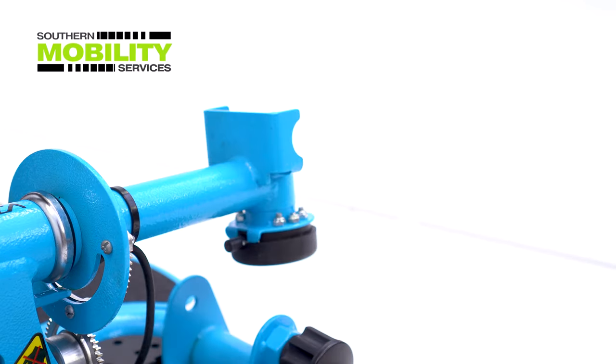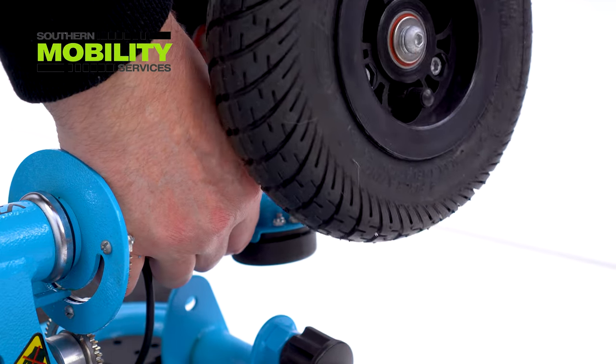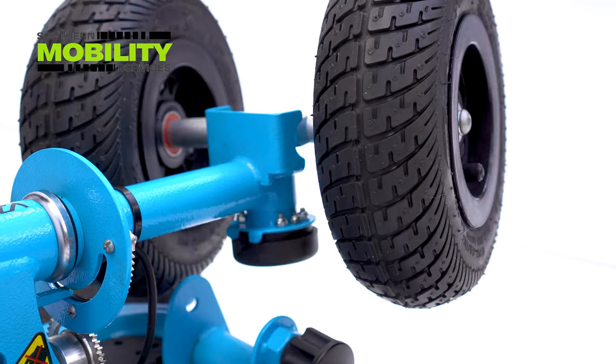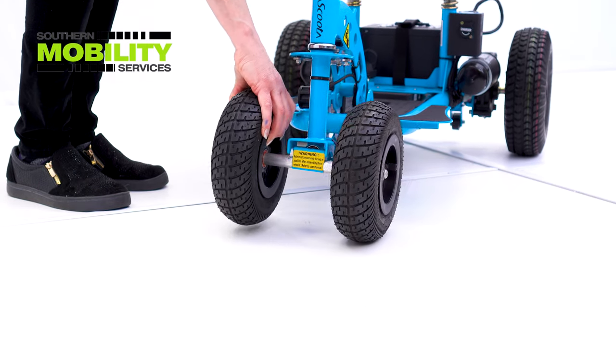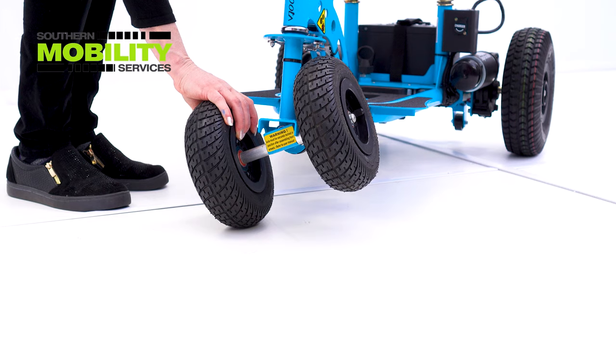Another handy feature is the quick release wheels, which can reduce weight and also save space. Articulating front wheels move to the rhythm of the road, keeping the Super Scooter stable.